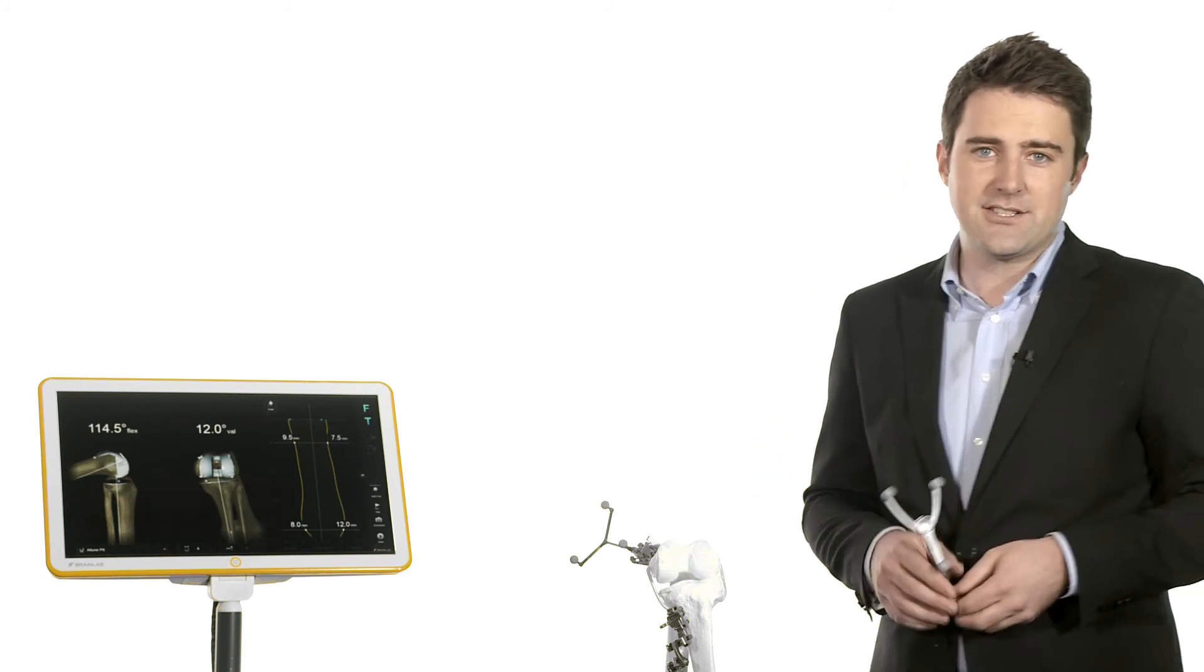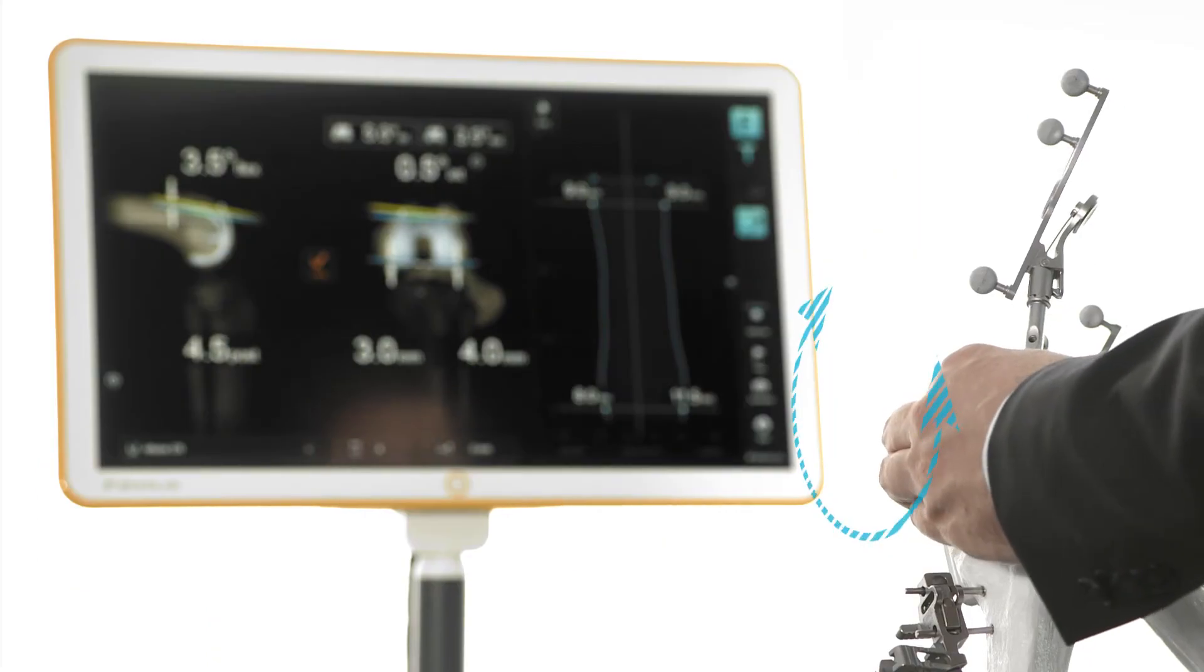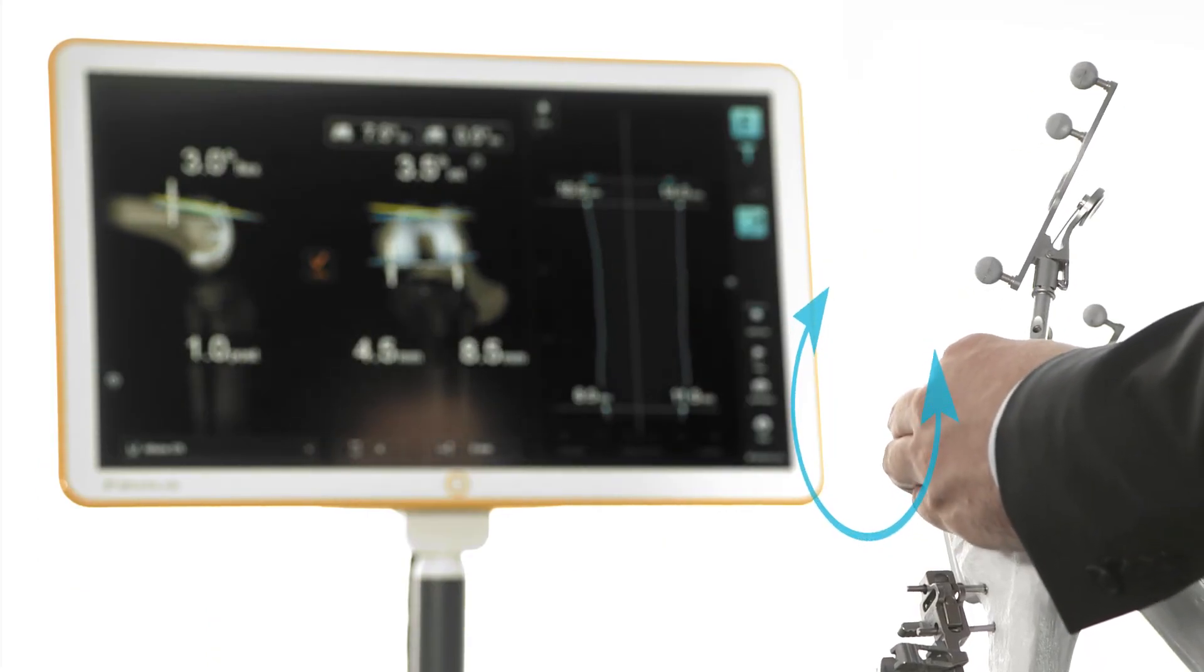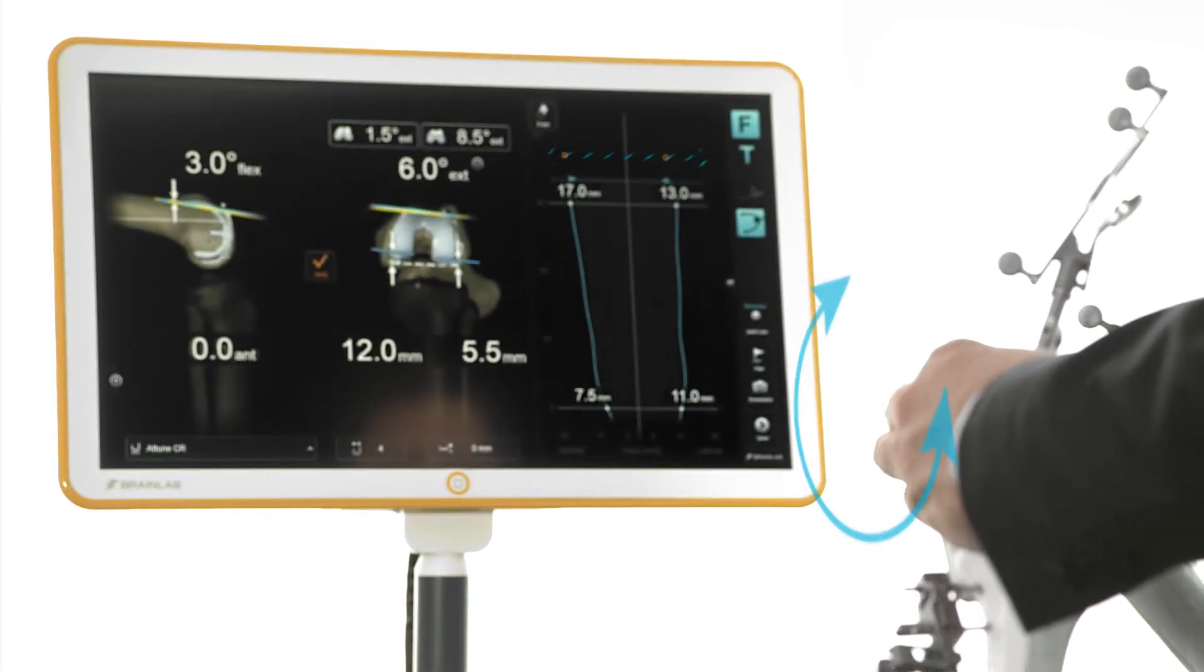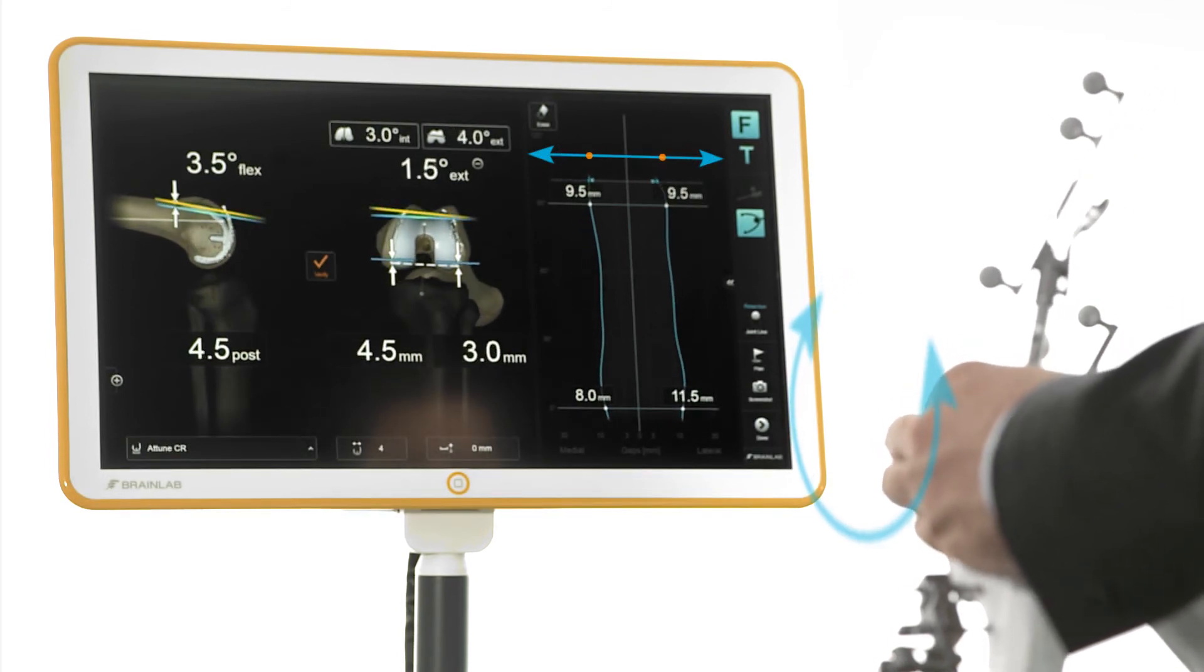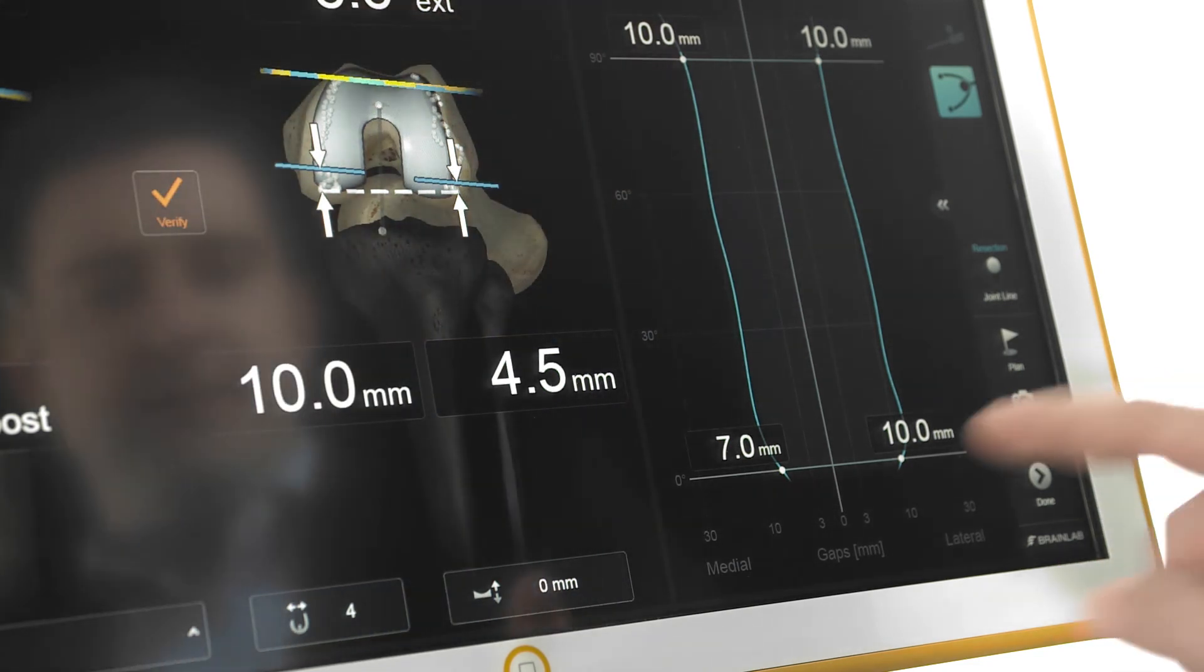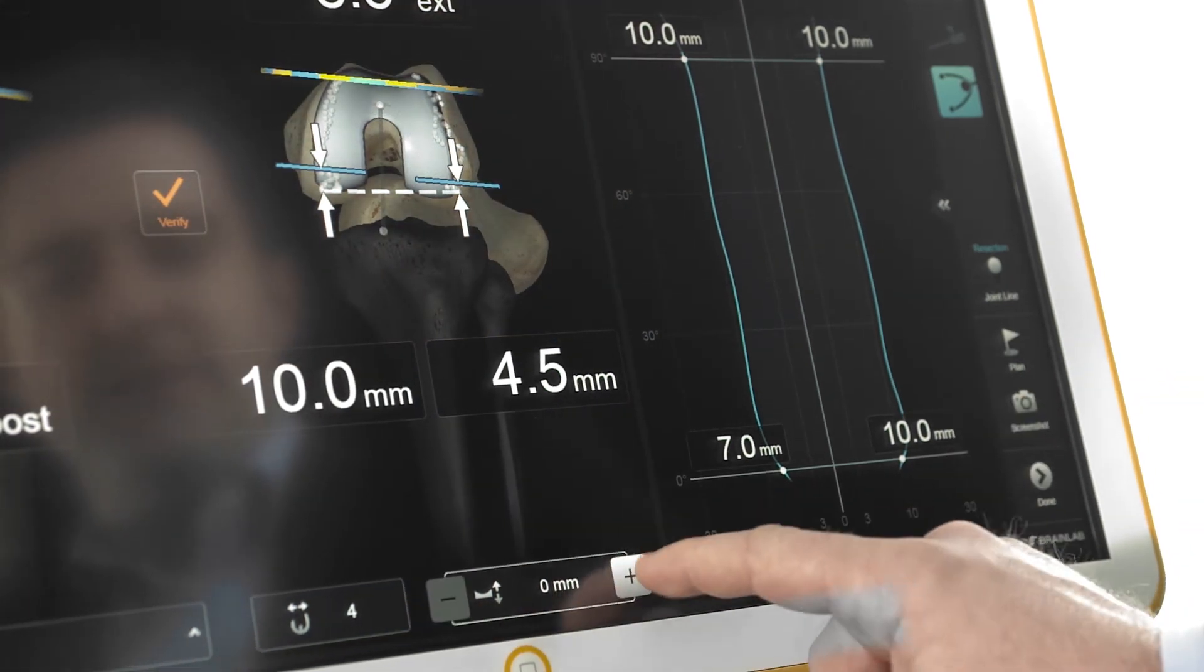Surgical interactions such as soft tissue releases are immediately taken into account. Finally, when performing the anterior cut, the software shows how rotation of the cutting block will affect final stability. The goal is to achieve two parallel lines indicating symmetrical stability of the joint. By selecting the insert thickness, the graph drifts to the zero line.